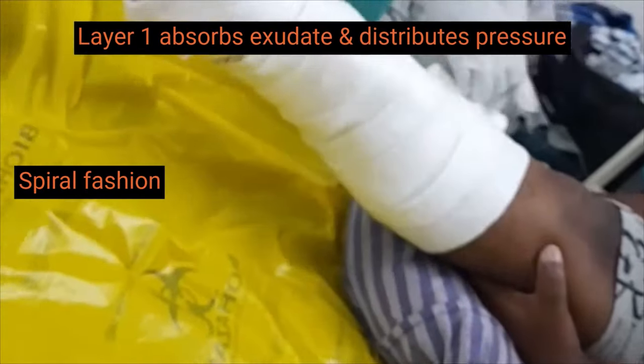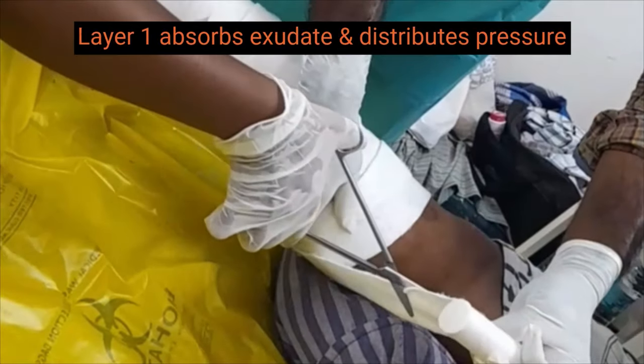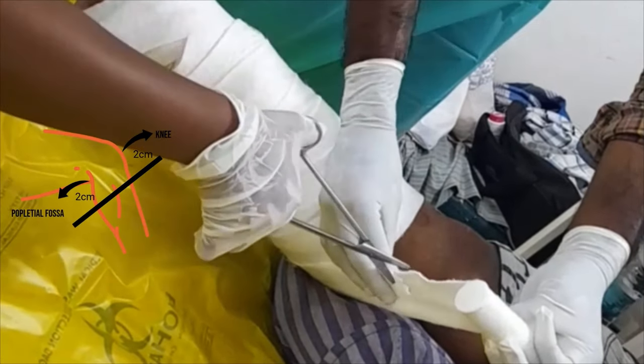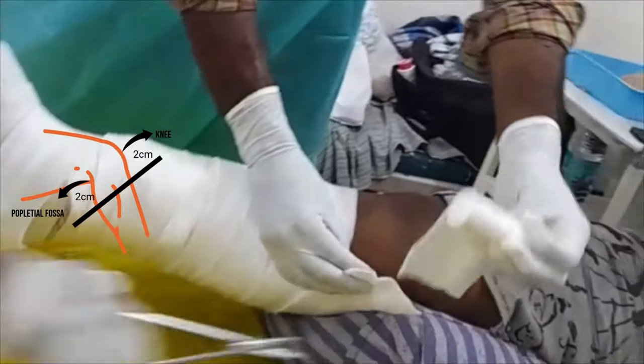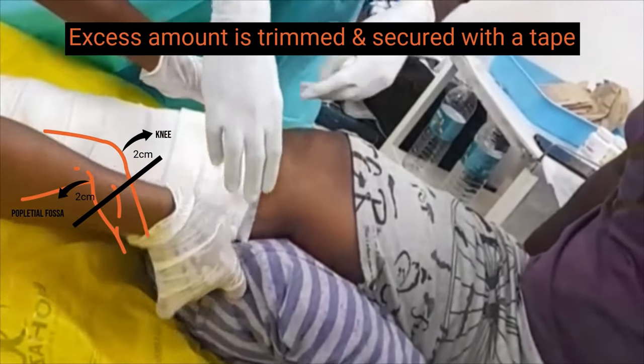This absorbs exudate and distributes pressure around the limb. The first layer is applied till 2 cm below the knee and popliteal fossa. The excess amount is trimmed and the first layer is secured with tape.